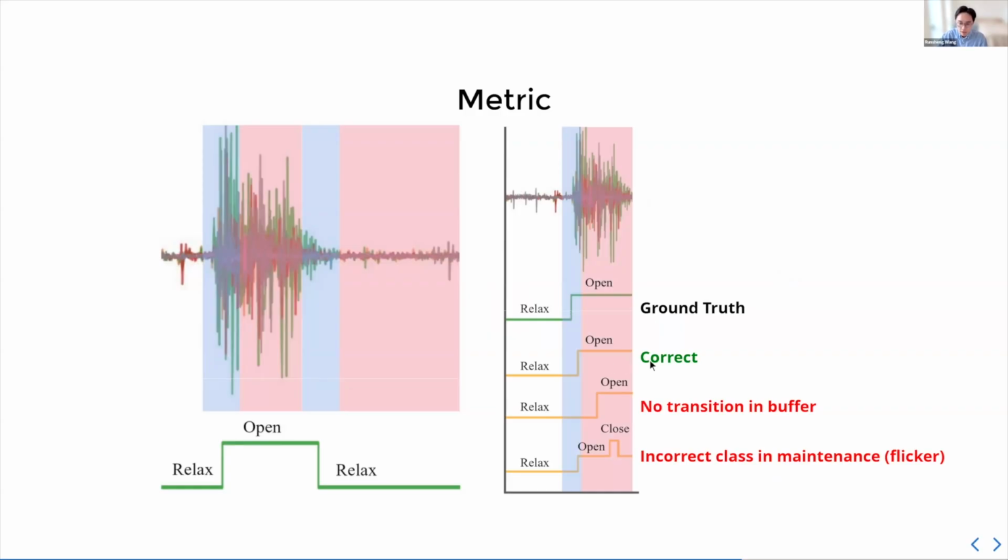You see the correct prediction on the second row, and you see a wrong prediction on the third row because there was no transition in this blue buffer. And lastly, you see this incorrect prediction on the fourth row because there's a close prediction where it should have opened in the maintenance period, right? So we use this metric so that whatever we do offline is meaningful and realistic performance when we transfer to the online setting.